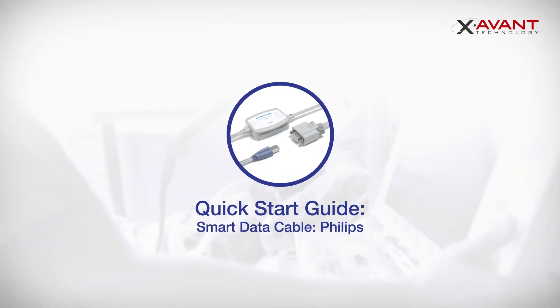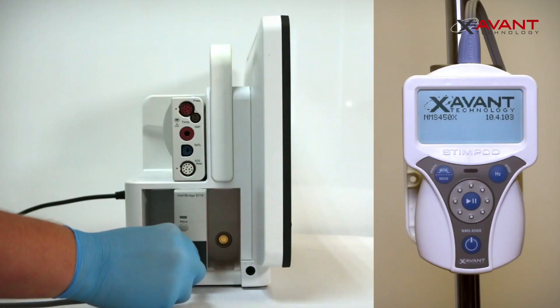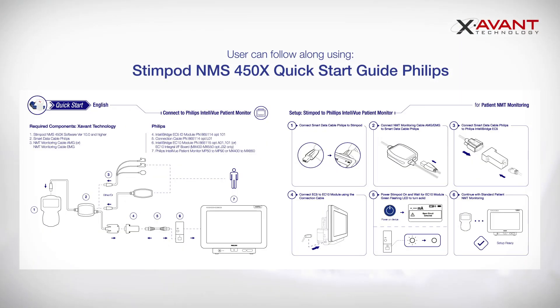Hi and welcome to our Stimpod Quick Start Guide for Smart Data Cable Philips. In this video we will demonstrate how to connect your Stimpod to a Philips patient monitor using the Stimpod Smart Data Cable Philips. You are welcome to follow along using our printed Stimpod Quick Start Guide.